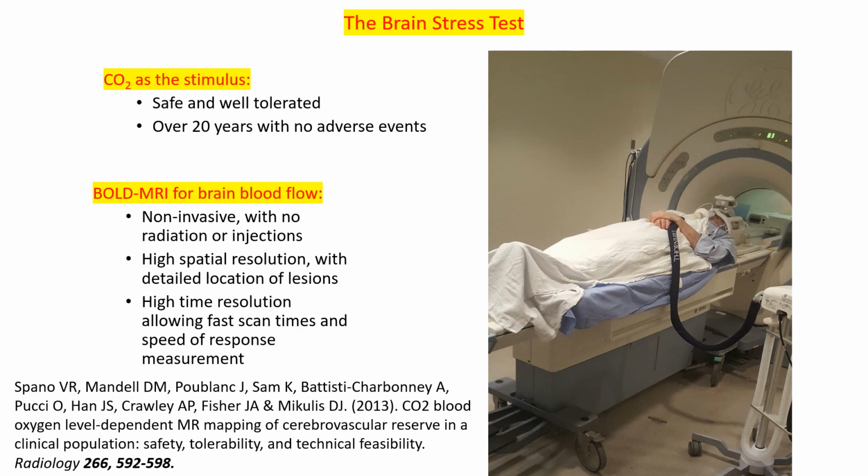Testing consists of the application of a precise, reproducible carbon dioxide vasodilatory stimulus, while maintaining oxygen at its normal resting value, coupled with BOLD MRI to measure changes in blood flow. The test is non-invasive, requiring no radiation or injections. BOLD MRI measurement of blood flow changes have high spatial and temporal resolution, showing detailed locations of lesions and permitting speed of response measurements.